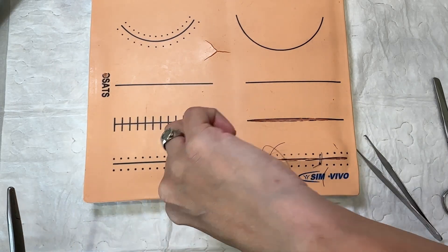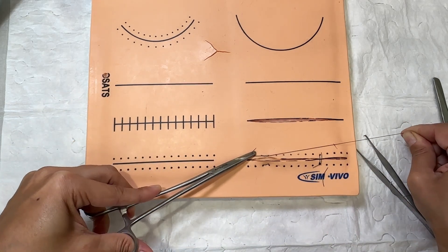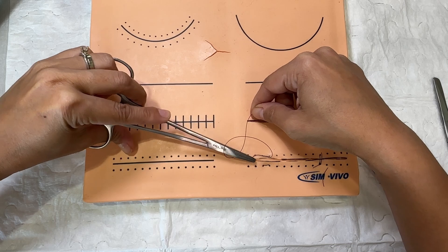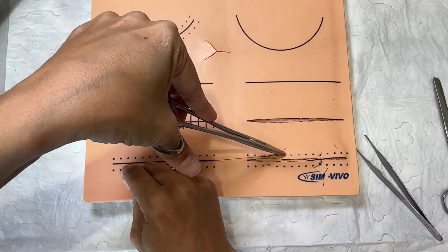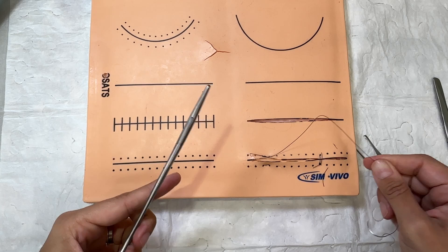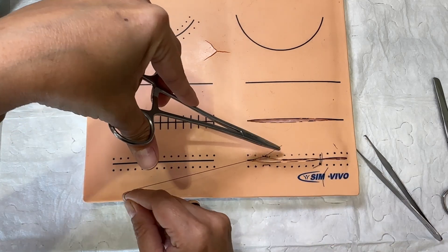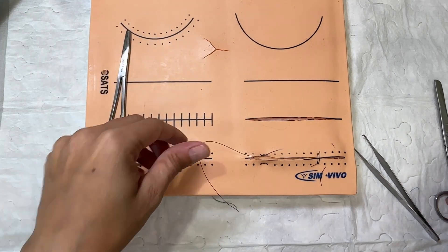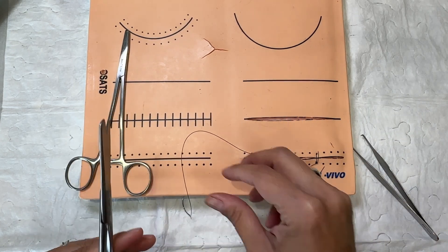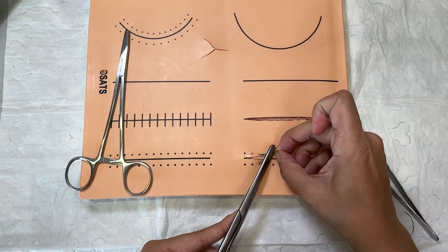Now I'm going to wrap again. I take my right hand and wrap it twice around the top, grip it, and pull across. I wrapped forward that time, so I'm going to wrap backwards once, grab my tip, and pull across — I need to switch my hands there. Wrap once, grab my tip, pull back this way. My hands are kind of switching from right to left. Then wrap backwards, grab my tip, hand switch — and there you go, there's a horizontal mattress stitch. I'll switch back and cut there — my scissors is worse than my suturing.